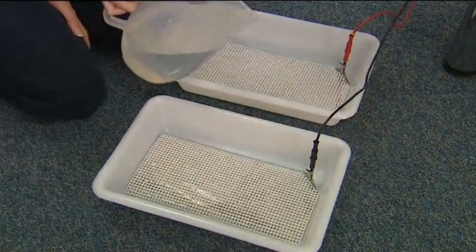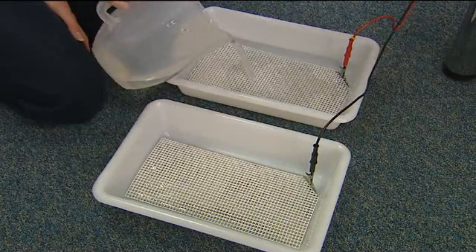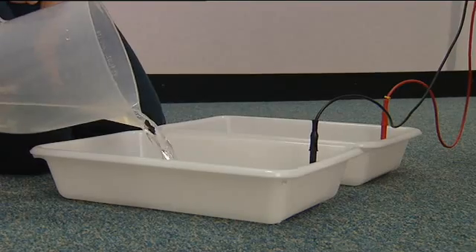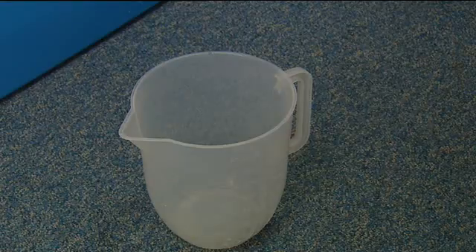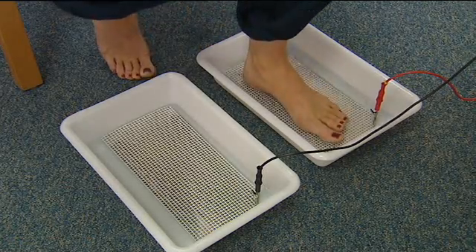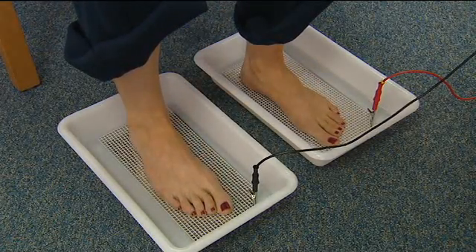Then pour in 500ml of lukewarm tap water to each bath. Place both feet into the baths, pressing lightly on the grating but avoiding all contact with the metal electrodes.